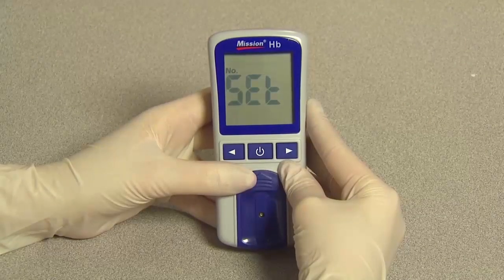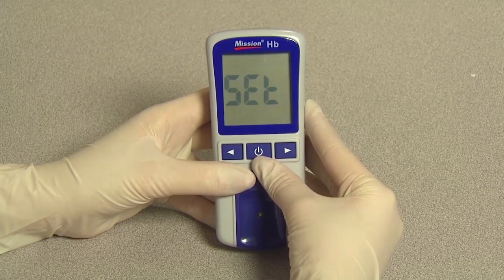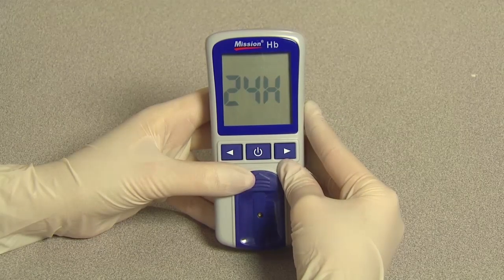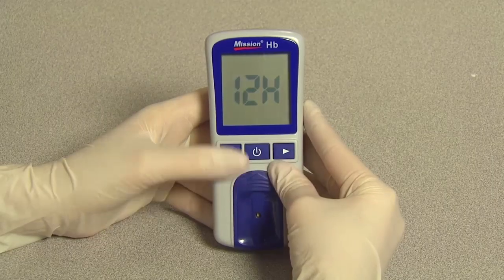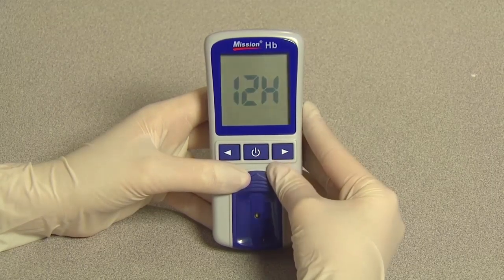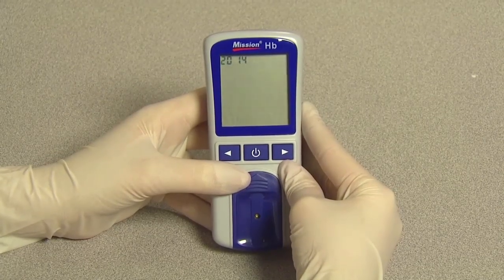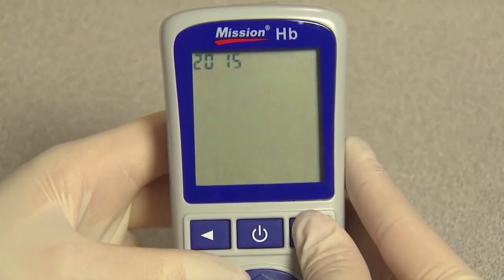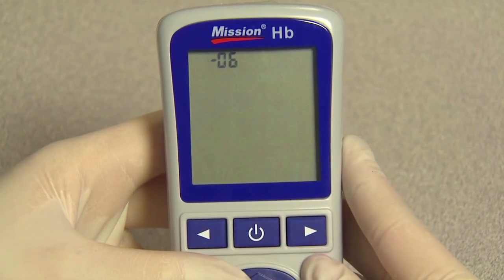Press the right button twice until the system setup screen appears, then press the power button to enter the system setup. The first option sets the clock to either 12 or 24 hour mode. Press right or left to switch between the two settings. Press the power button to save and advance to year setup. The year will appear at the top of the display. Press right or left until the correct year is displayed, then press the power button to save and enter month and date setup.